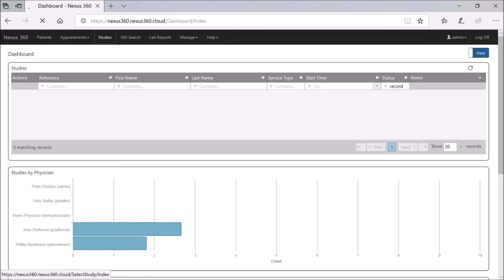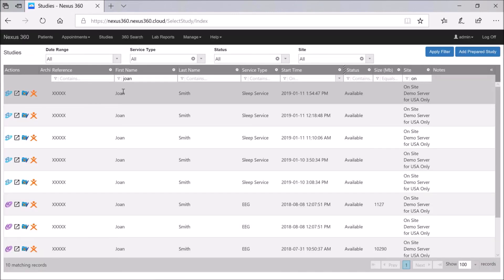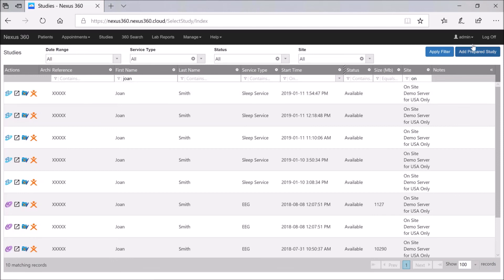That's available if we log back into Nexus 360 via the web browser and go to our Studies tab. We can see the study here, and scrolling across to the status column it now shows as Available — fully uploaded, matching the status in the Nexus 360 Control Center. Now that everything has been pushed to the server and the status is Available, we can go into Profusion PSG and review all the data and video through the web browser, and score if needed. Thanks for your time.